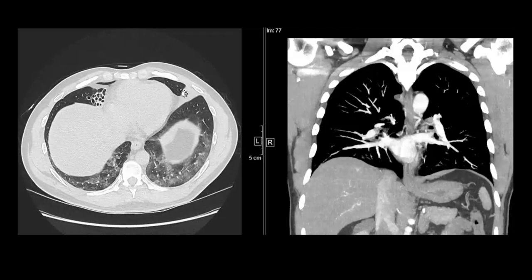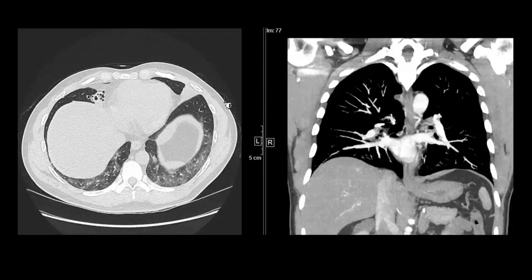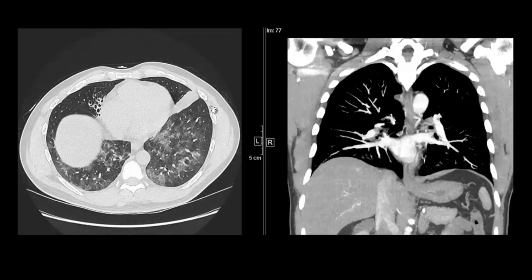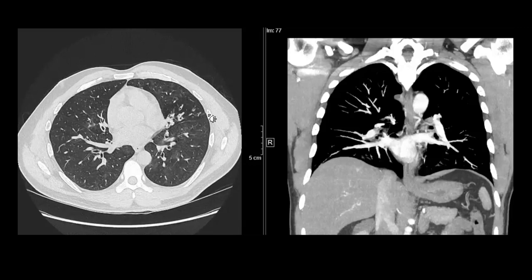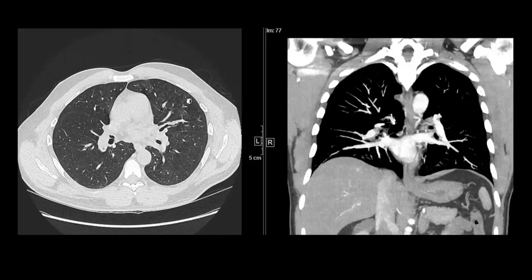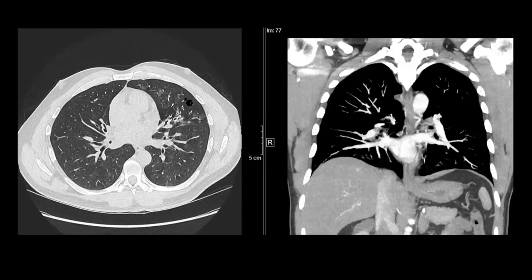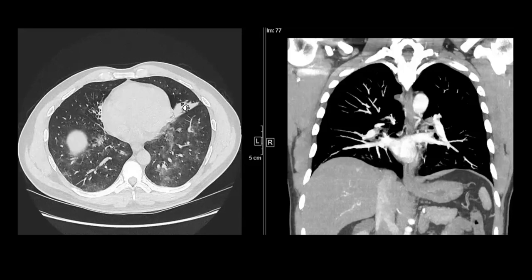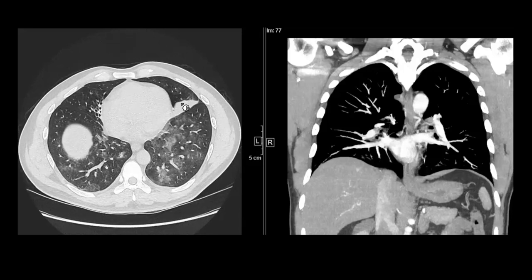Pulmonary hemorrhage, diffuse alveolar hemorrhage, Lady Windermere syndrome — you're right. This patient also had Lady Windermere syndrome as we discussed last time. Bilateral bronchiectasis in the right middle lobe and the lingula — everyone knows we can see that in the lingula and the right middle lobe. I reported this as diffuse alveolar hemorrhage, less likely to be infective. Even coronavirus on imaging can have peripheral ground glass opacities, but this imaging appearance is not very typical for coronavirus, so that was very low in our differential.